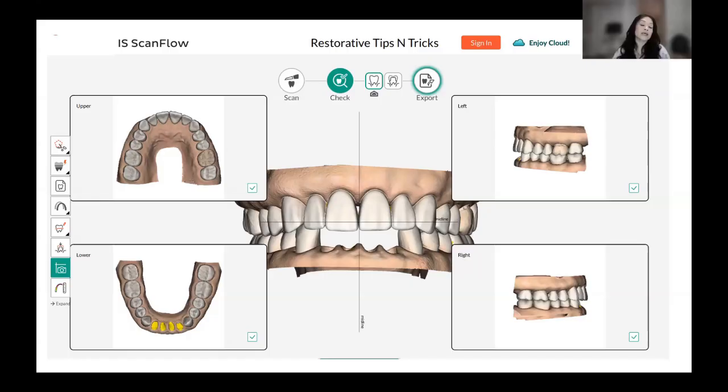Yeah. It also can create a report. And sometimes we do this even just to send to the patients. Some doctors just like to have their name stamped on stuff and just show them what they can do within their software and scanner.